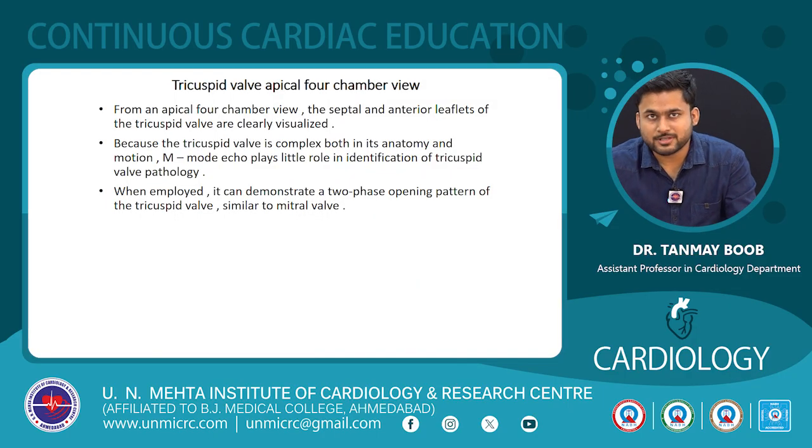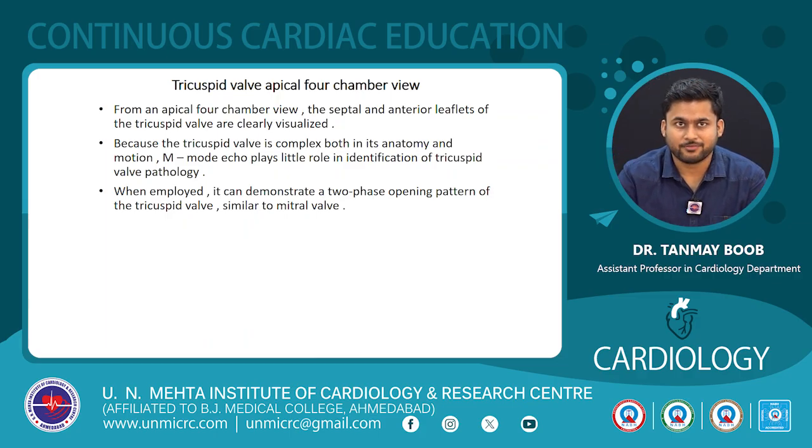The apical four-chamber view for the tricuspid valve. From the apical four-chamber view, the septal and the anterior leaflets of the tricuspid valve are clearly visualized.